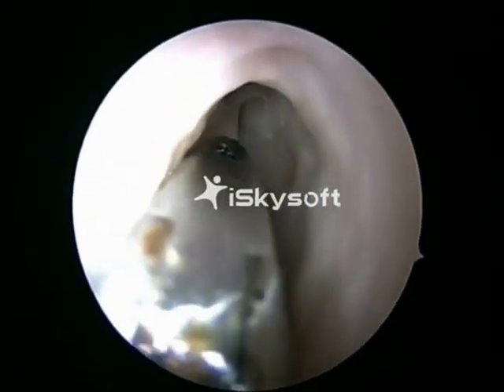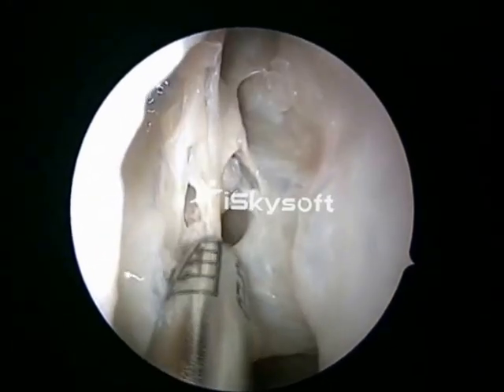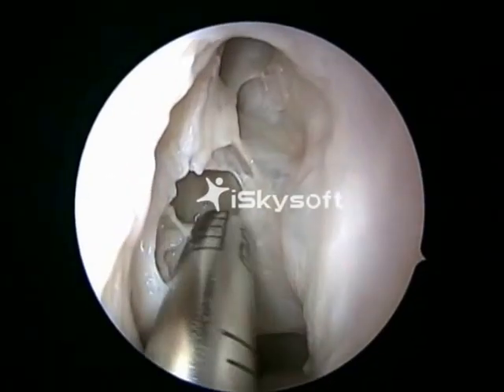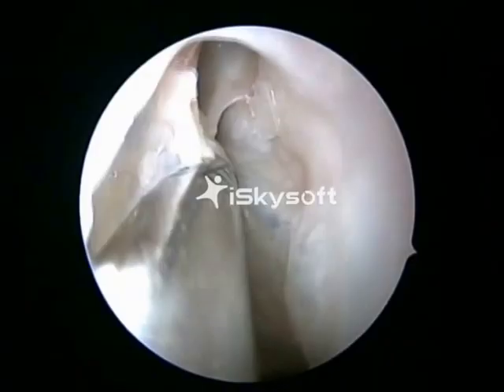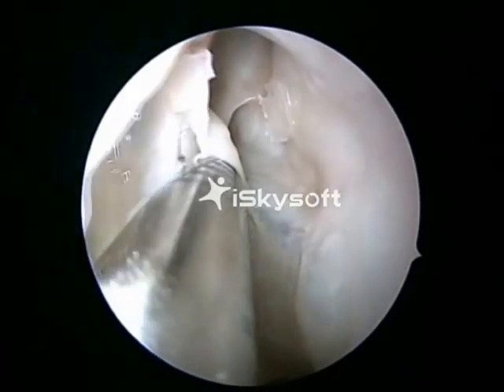The next step is to do a bullotomy. The bulla has got 6 walls. We puncture the bulla in its anterior wall. The anterior and inferior quadrant is punctured. We use a microdebrider, and once we open the bulla, we are now able to see the basal lamella, in fact the retrobullar recess. We are now using a debrider and the bulla is being removed.